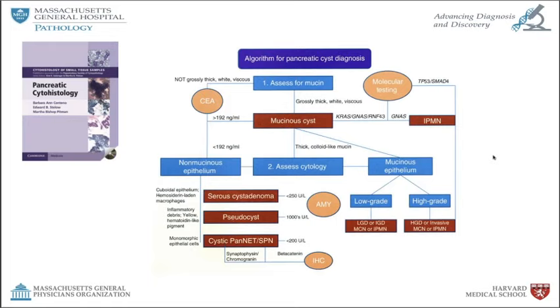Of carcinoma, when they're solid and cystic and big and ugly looking on imaging, that's the way they're going to look. And those you get enough material to make a cell block. When you're dealing with a 2 centimeter unilocular cyst, you're going to get 1 cc of fluid, and there's just not enough to do much with that. So this is the kind of algorithm, tissue triage, that helps us work up that very valuable, often scant fluid for the most information that we can get.